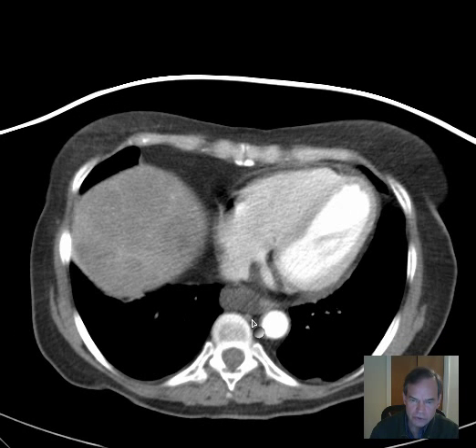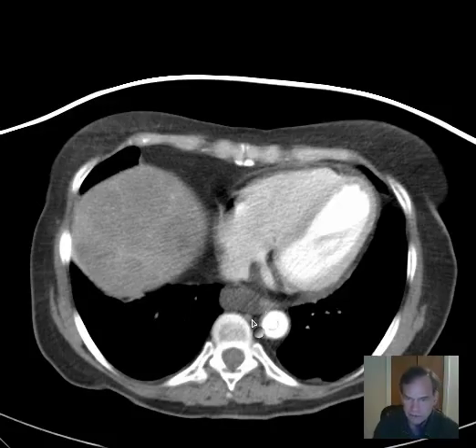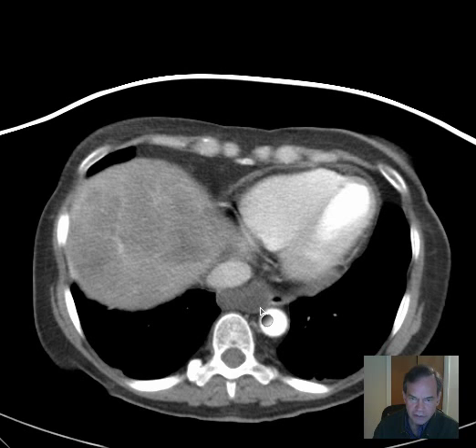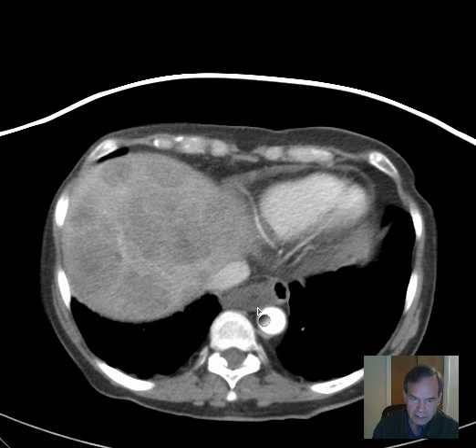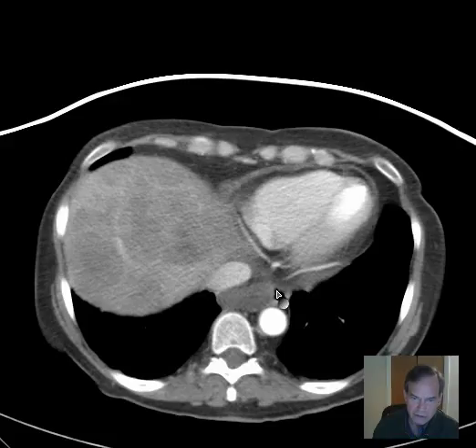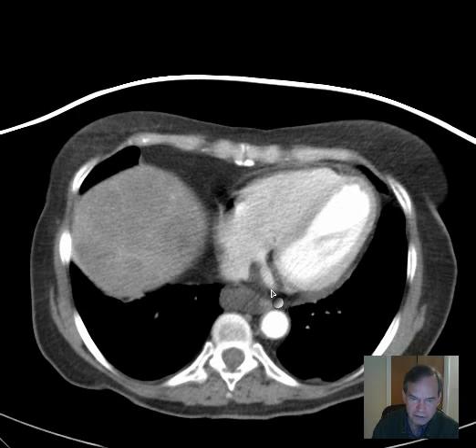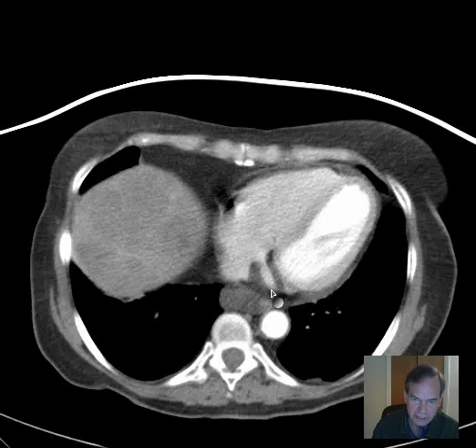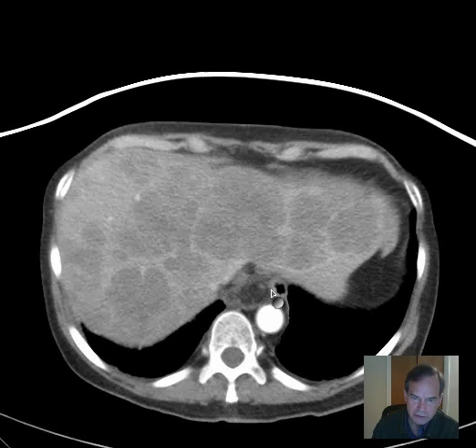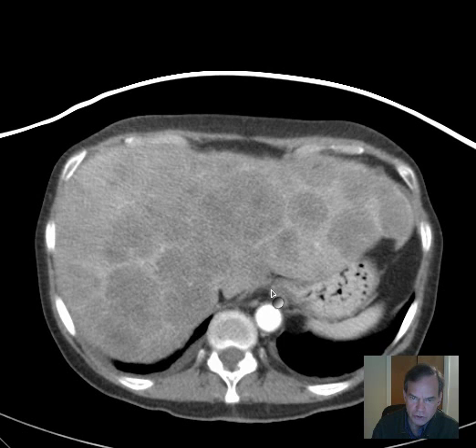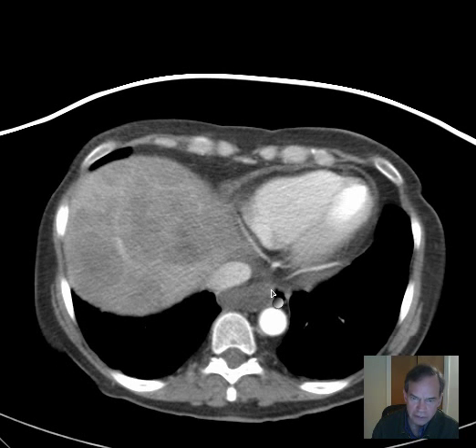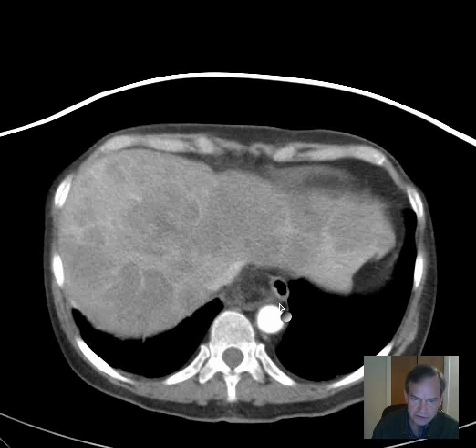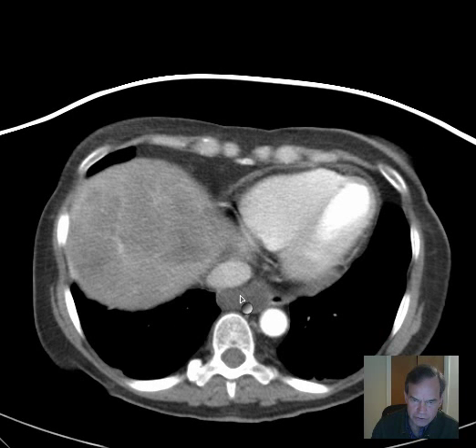Now we're getting close to the diaphragmatic hiatus where the esophagus passes through the diaphragm and becomes the stomach. And here is the esophagus. But here we have this relatively low attenuation soft tissue abnormality to the right of the esophagus, right by the gastroesophageal junction — the GE junction — really immediately to the right lateral aspect of the distal thoracic esophagus. So that looks very suspicious.